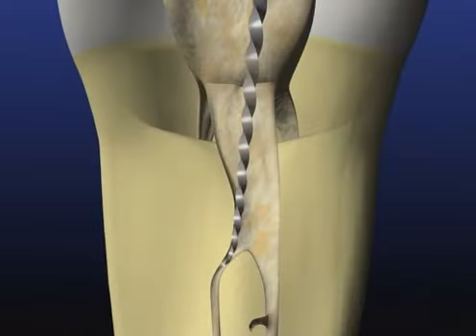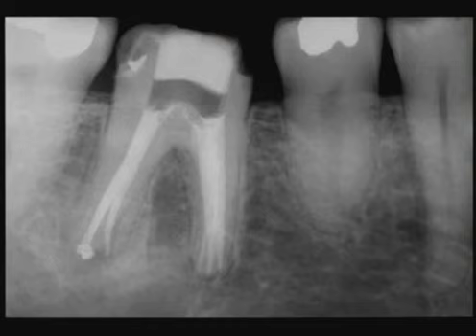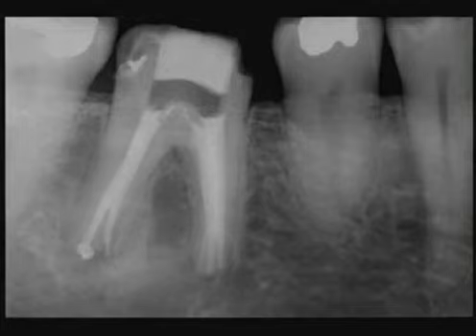At a higher magnification of that graphic, you can begin to see the end of the instrument is just gently inserted into that branch so we can begin to remove triangles of dentin. A postoperative radiograph shows the non-surgical retreatment, a packed third mesial system, and corkage of 5 apical portals of exit.